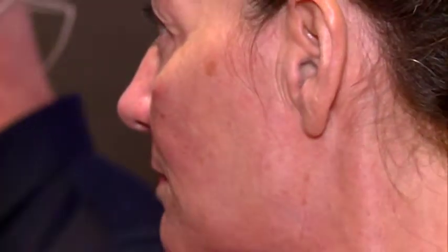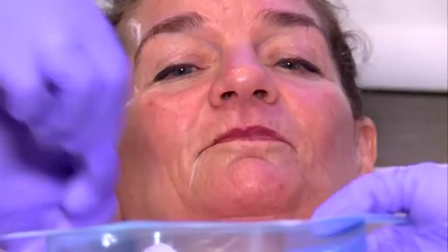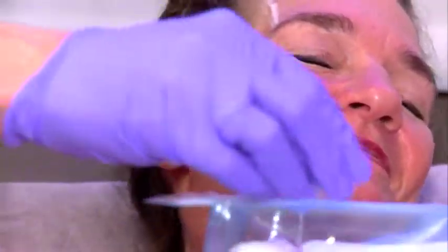I do it very easily. I'm actually a cannula guy, to be honest, but in this case I can show you a very nice trick, which is quick and safe and easy with the needle. Yeah? And we can also do some mid-face, but I think I do the other patient for the mid-face. It's better. Which is nice.